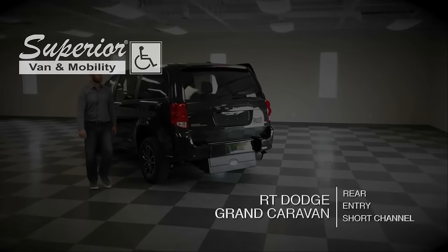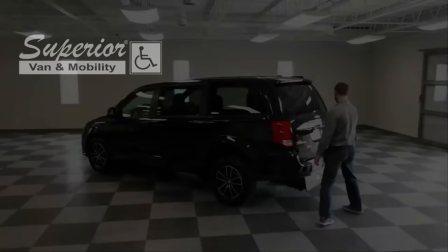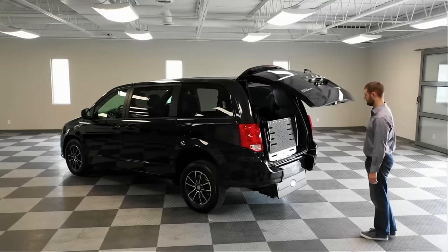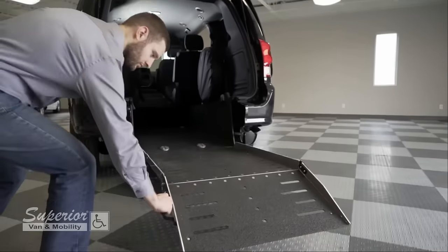Here you're looking at our ADA compliant rear entry shortcut conversion. To deploy, simply pull the handle towards you and let the spring-assisted counterbalance ramp do all the work.